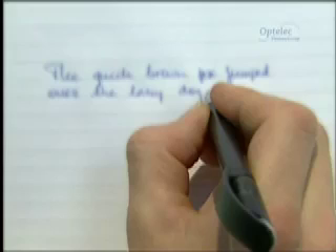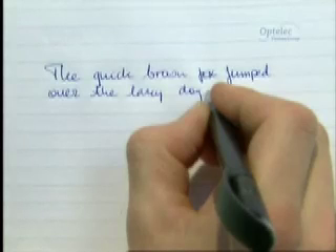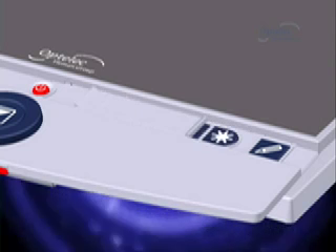Less frequently used buttons are positioned behind a slider. Turn off autofocus to focus just on the table, not on your hand. Adjust the brightness to your own needs. Set it and forget it.